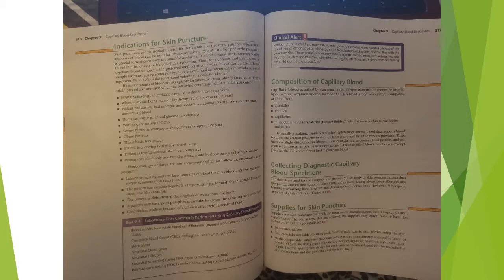Collecting diagnostic capillary blood specimens. The first steps used for venipuncture procedure also apply to skin puncture procedure: preparing oneself and supplies, identifying the patient, asking about latex allergies and fainting, performing hand hygiene, and cleansing the puncture site. However, subsequent steps are slightly different.